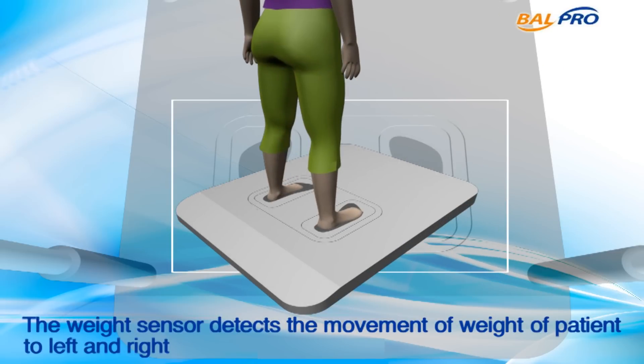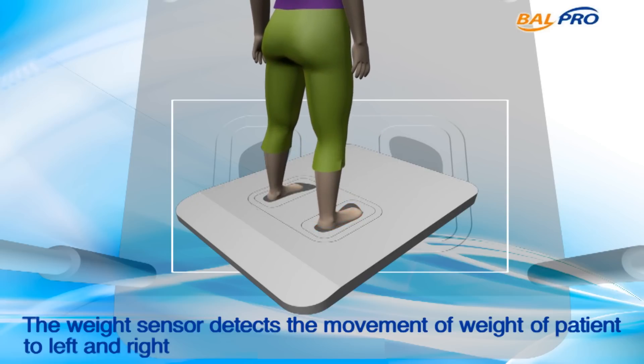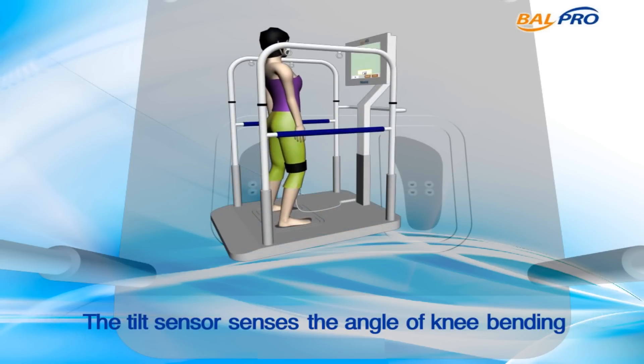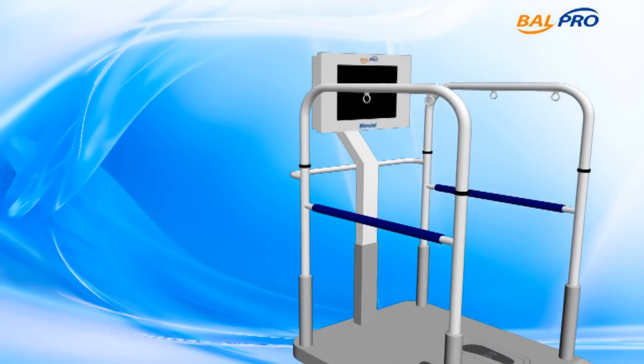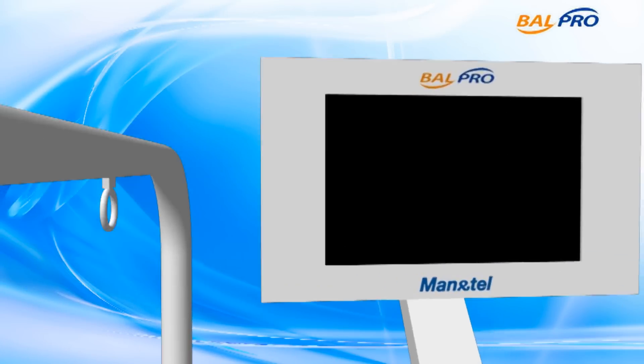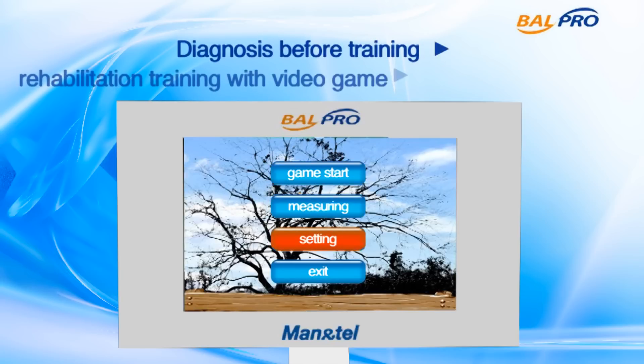The equipment consists of a computer which uses sensors to measure the patient's leg muscle strength and balance, by measuring the weight difference between the left and right body and the motion range of legs. It also helps the user to exercise and strengthen muscles through a simple video game on his or her own.